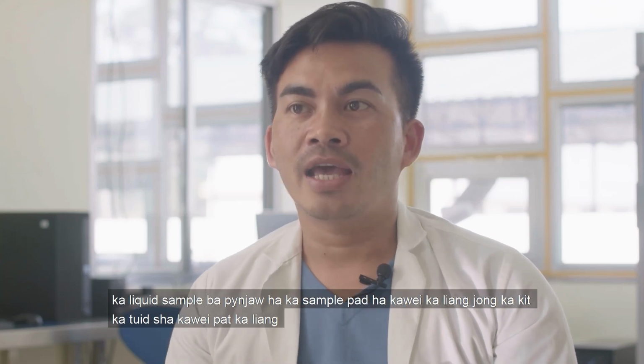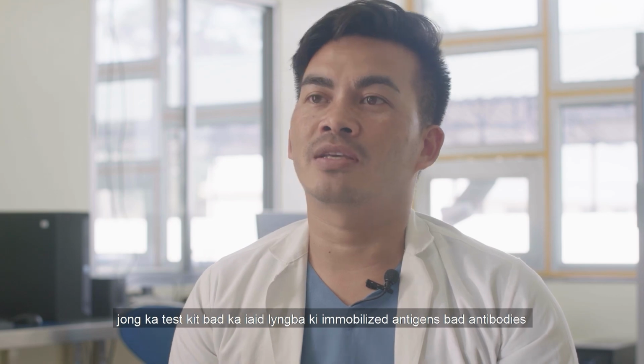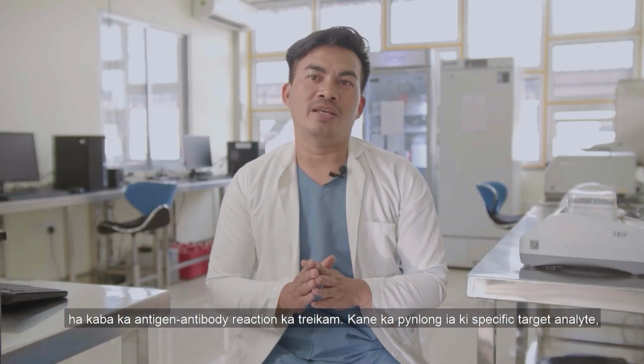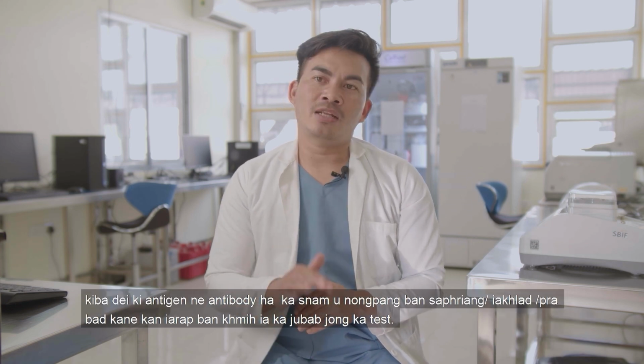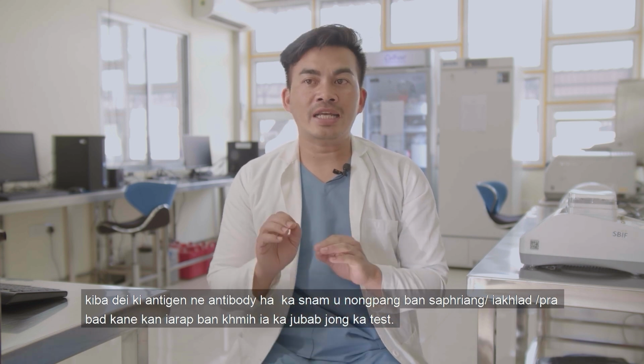other end of the device and made to pass over the immobilized antigens or antibodies, wherein the specific antigen-antibody reaction takes place. This leads to the separation of the specific target analyte, that is either antigen or antibody, from the patient's blood, which will help in the interpretation of the test result.